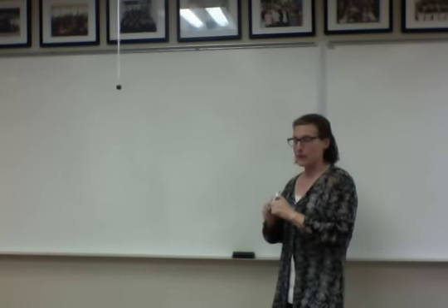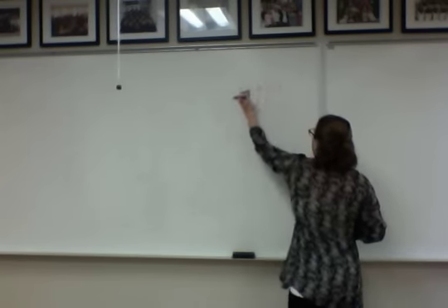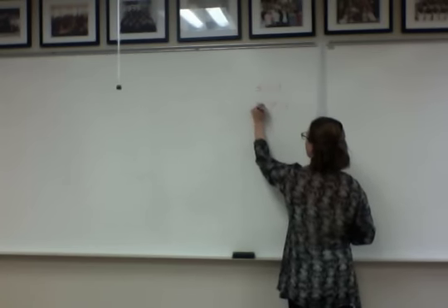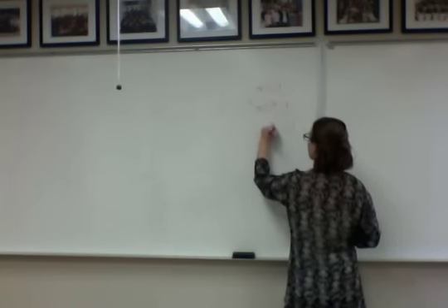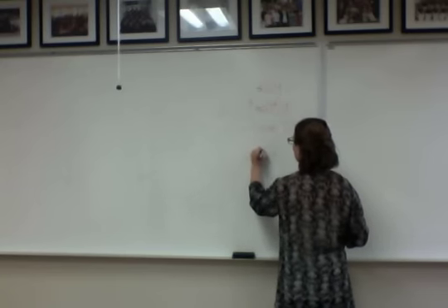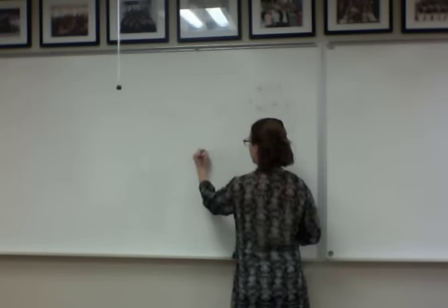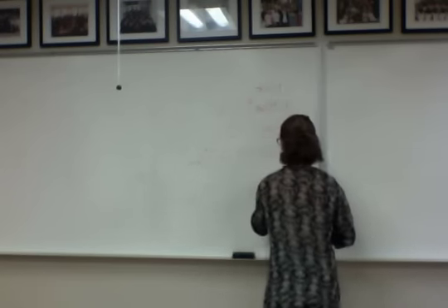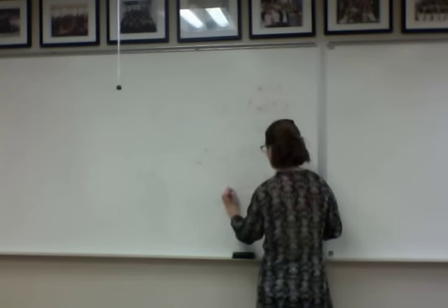This is a pretty deep tissue again, so I think I'm going to go with 1 megahertz. And for my intensity, I'm going to try starting with 1 watt per centimeter squared. And I want my treatment time to be about 10 minutes. So if I did 100% duty cycle, that would be 0.2 times 1. So I get 0.2 degrees per minute. I'm going to pick a duty cycle of 20%. So I'll take my 0.2 that I got here times 0.2.